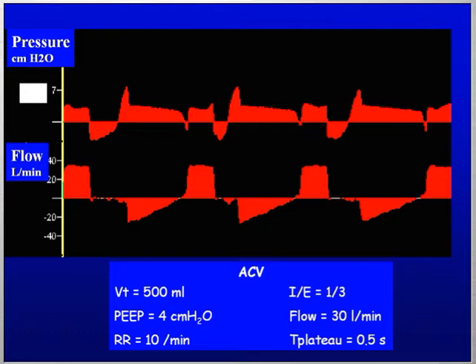If you look at flow, you recognize a very classical assist-controlled ventilation with square flow, an inspiratory pause, and then expiration. And you see on the airway pressure that really the patient does not look comfortable. It's very different from a very regular increase in the airway pressure wave shape. And we found that this patient was ventilated with a low peak flow of 30 liters per minute, whereas the standard should be more around 60 liters per minute.